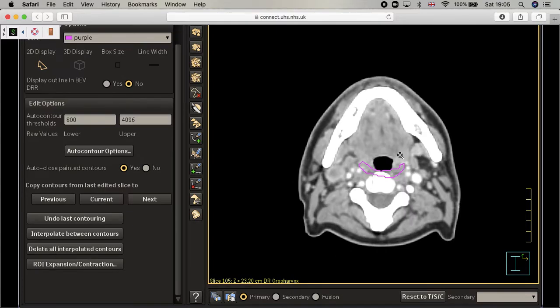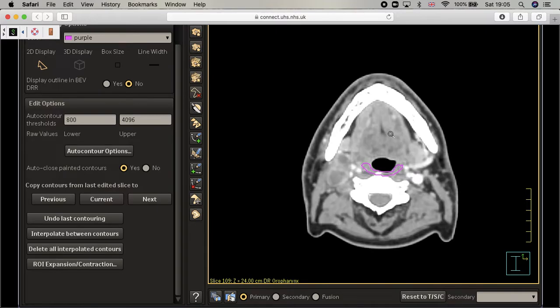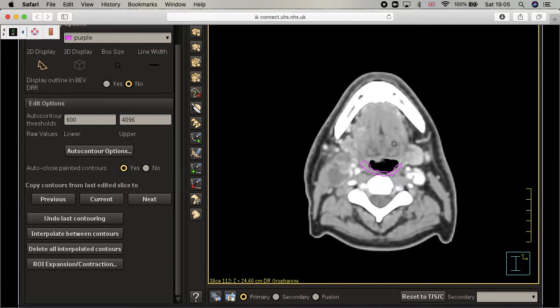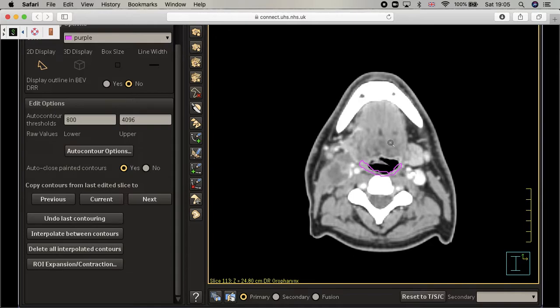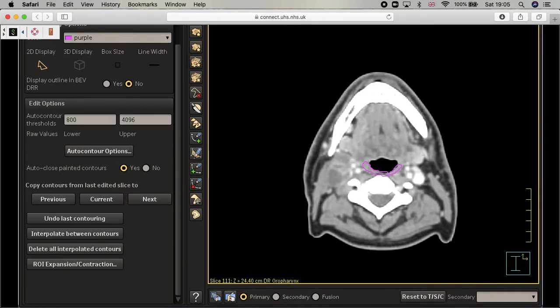What else do you have to know? There are other structures involved in swallowing. So they now put the genioglossus muscle, they put the hyoglossus muscles, but I think this would be too much for you to draw.